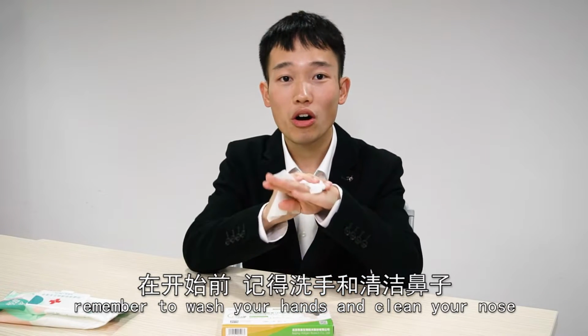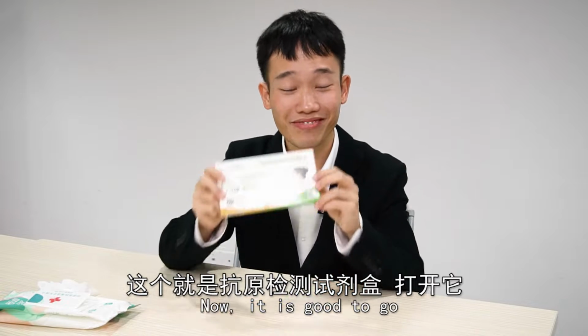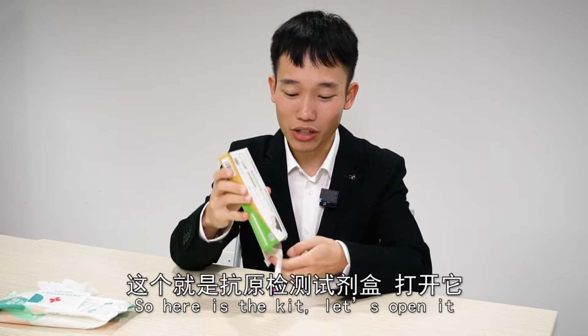So let's have a try. But before that, remember to wash your hands and clean your nose. Now it's good to go. So here is the kit. Let's open it.